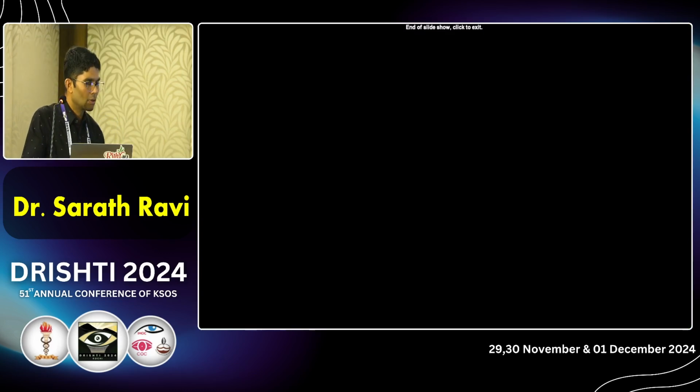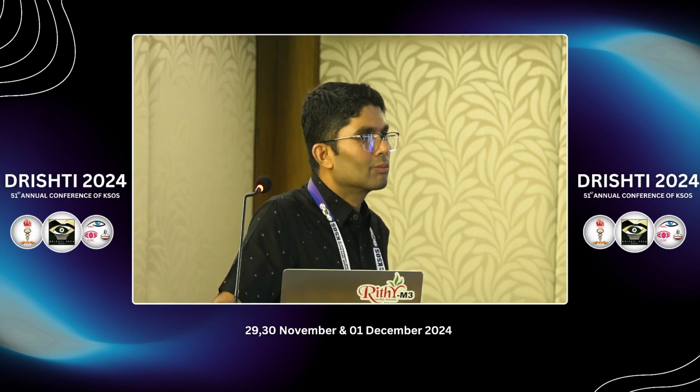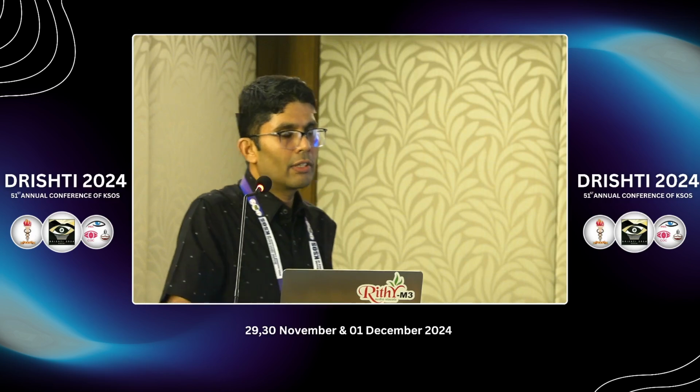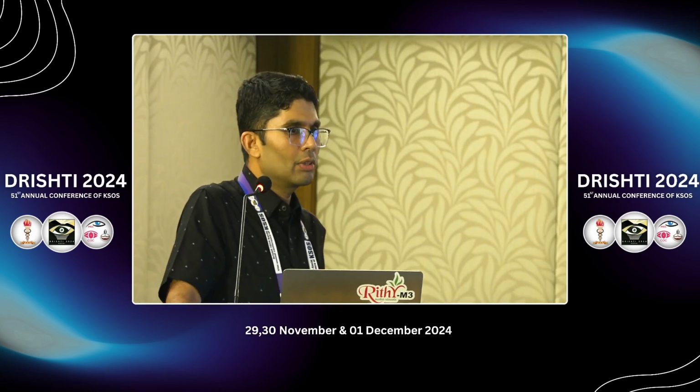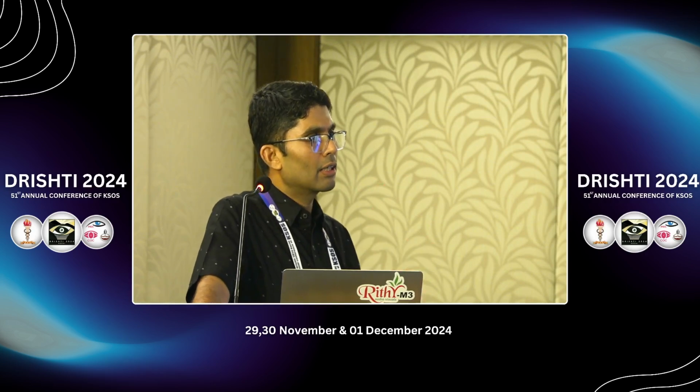Thanks, Sharath. Nice talk. So most of the cases you seem to be doing a combined approach for coexistent disorders. Are there any situations where you would prefer a phased, stepwise intervention? So in our setup, we mostly do a combined procedure, but as you see, there could be all this IOL shift and also the optic capture happening.